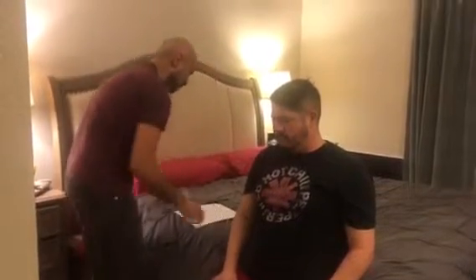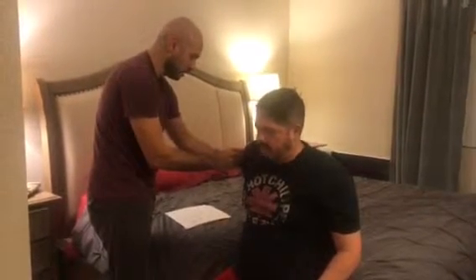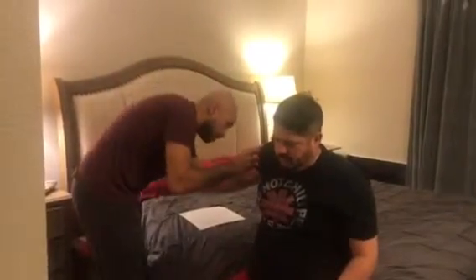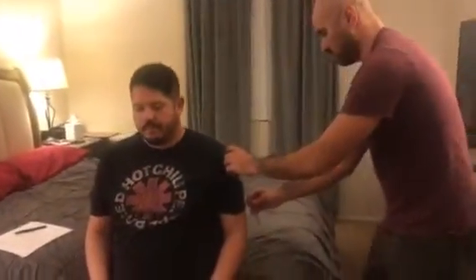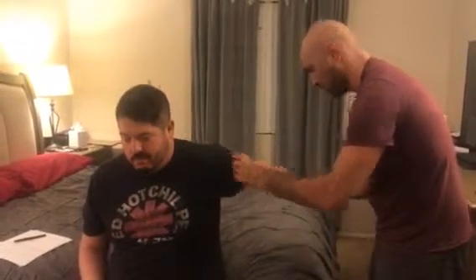Next is going to be shoulder extension. We're going to have the fulcrum right at the same spot. I'm going to have you bend your arm back as far as you can go. Right about 79. Go ahead. A little lower at 69.